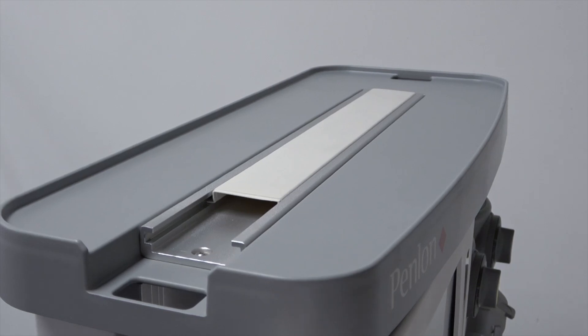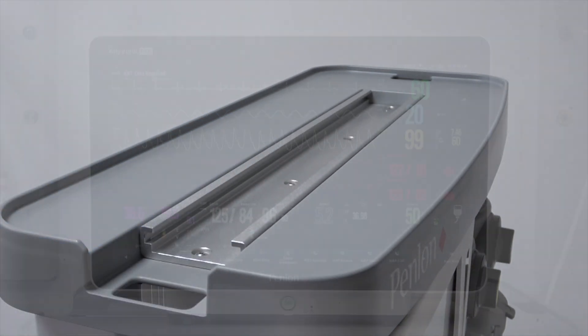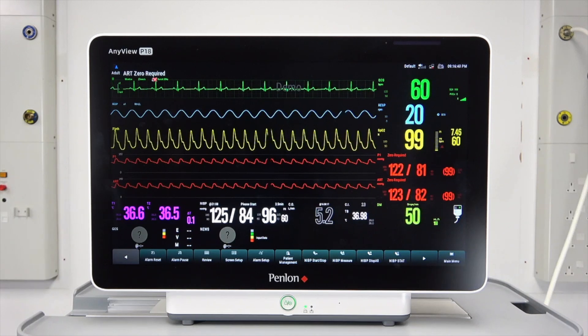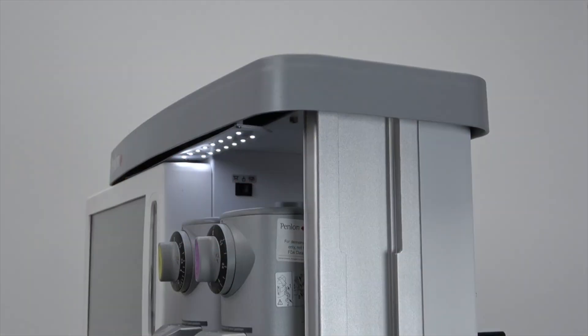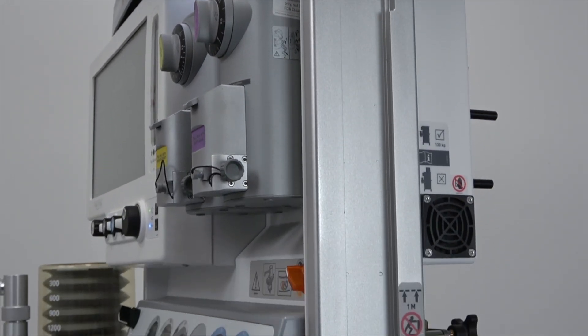GCS compatible aluminium uprights are integral to the frame and built into the monitor shelf for flexible mounting of your patient monitor of choice. This is also convenient for mounting pumps, especially for TIVA, and the mounting of an additional writing tablet.